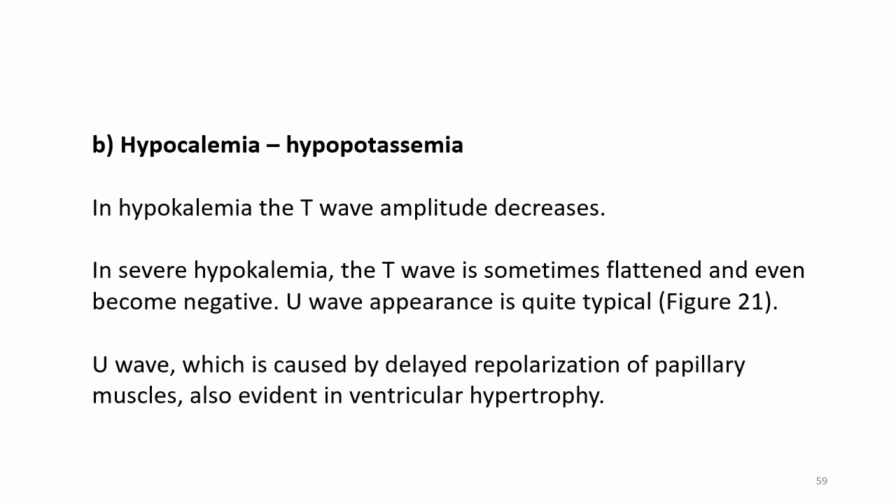So, hypokalemia or hypopotassemia. In hypokalemia, the T wave amplitude decreases. In severe hypokalemia, the T wave is sometimes flattened and even becomes negative. U wave appearance is quite typical. U wave, which is caused by delayed repolarization of papillary muscles, is also evident in ventricular hypertrophy.